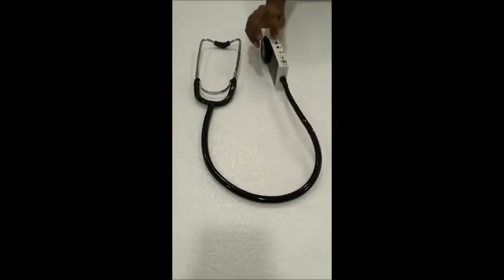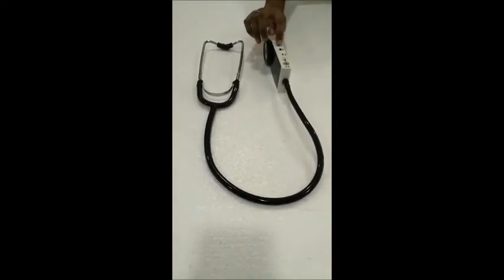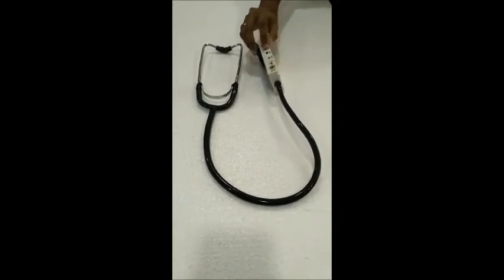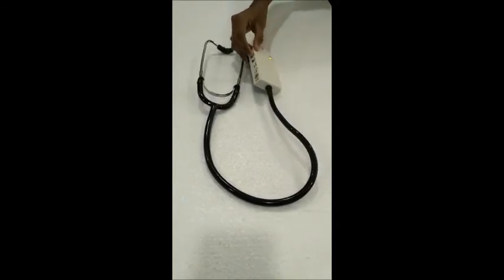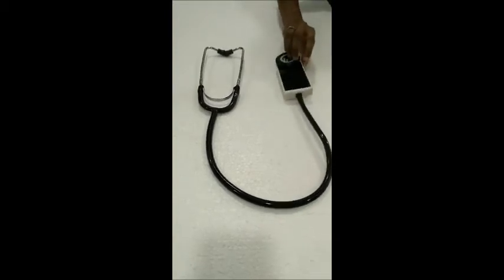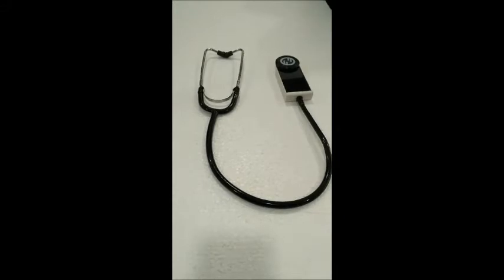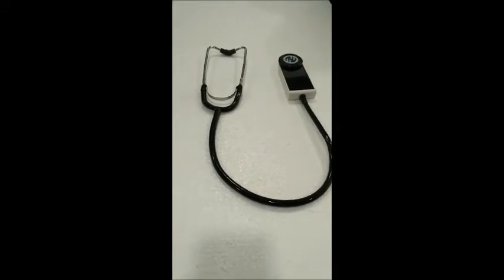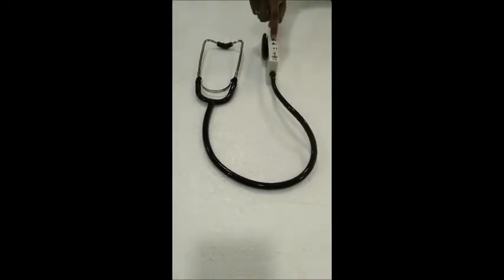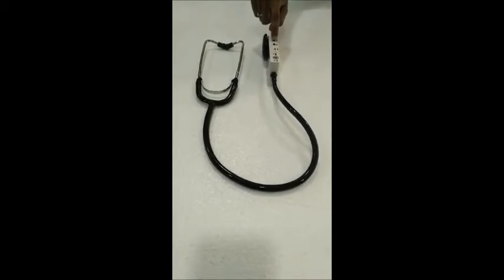Next is the power switch. On pressing this switch, it turns on the stethoscope and one could notice the LED at the back side of the stethoscope turning green. When the diaphragm is placed on the chest, the doctor can hear the oscillation through his earpieces. This switch should be pressed continuously till the end of the assessment.